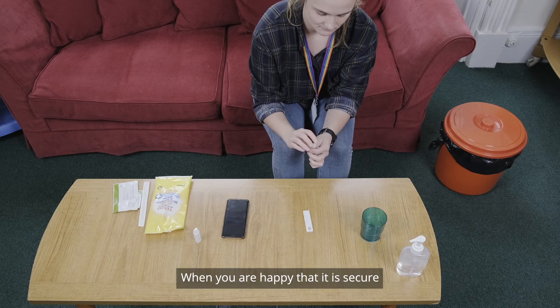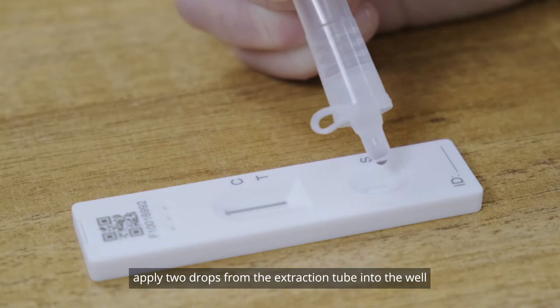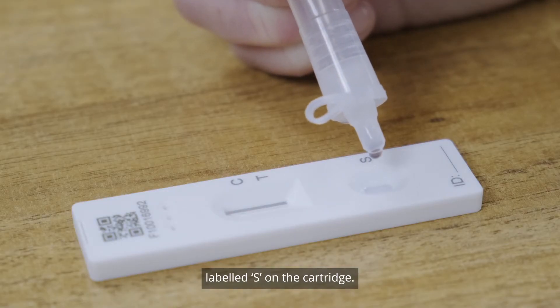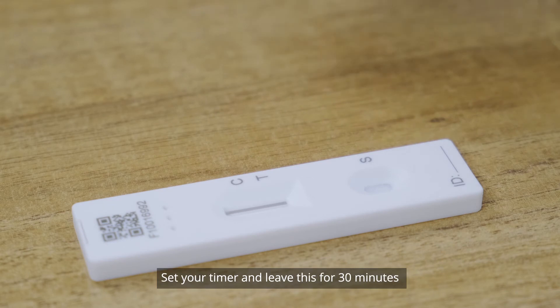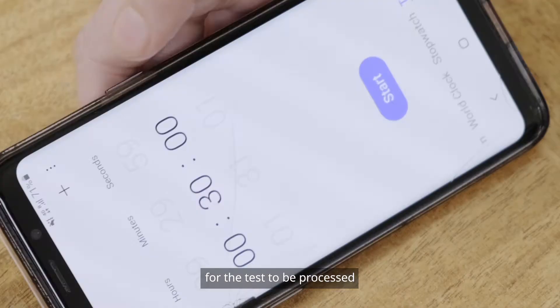Take the extraction tube and secure the attached nozzle to the top. When you're happy that it is secure, apply 2 drops from the extraction tube into the well labelled S on the cartridge. Set your timer and leave this for 30 minutes for the test to be processed.